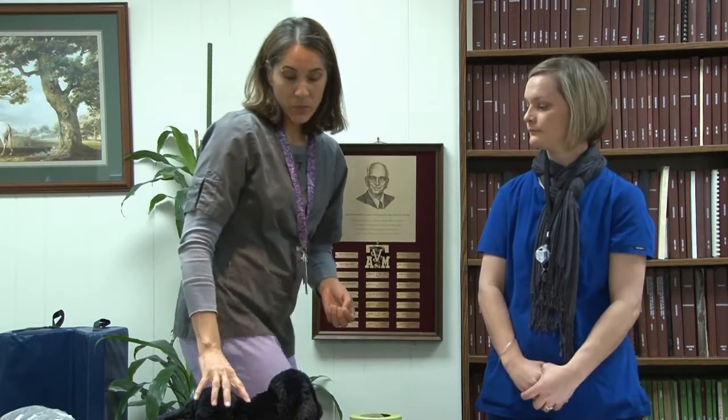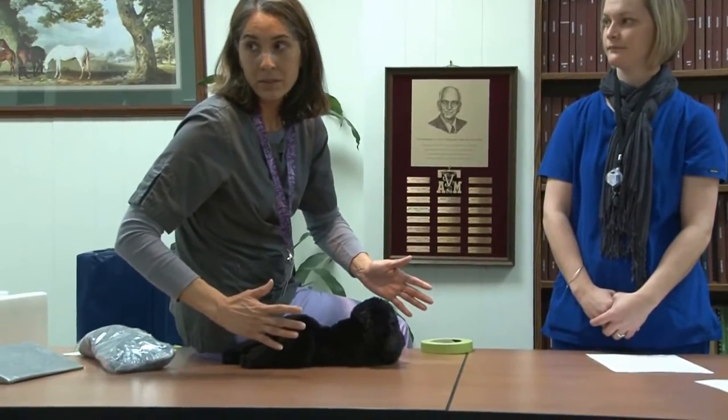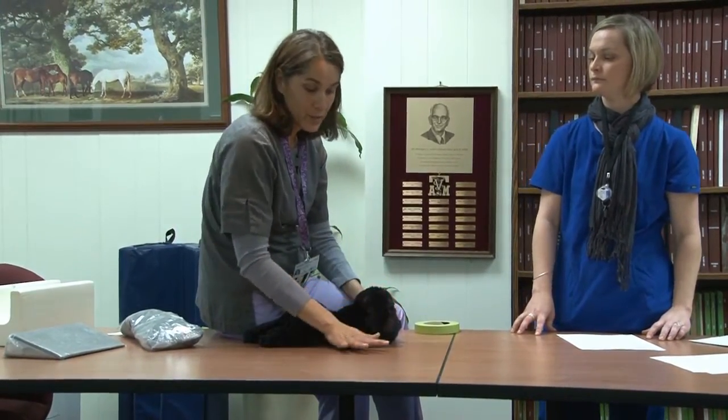When taking radiographs, even though your hands are leaded, you must make sure you are not in the primary beam — you will receive scatter, but being in the primary beam means receiving a large radiation dose. Also, people sometimes want to sit on the table when taking the film, and may have an ungloved hand in view — that is not allowed. If you're sitting on the table, you're still getting scattered radiation. No sitting on the table.